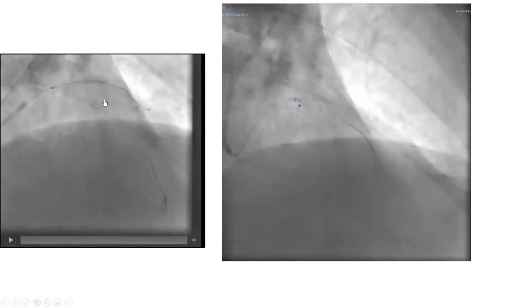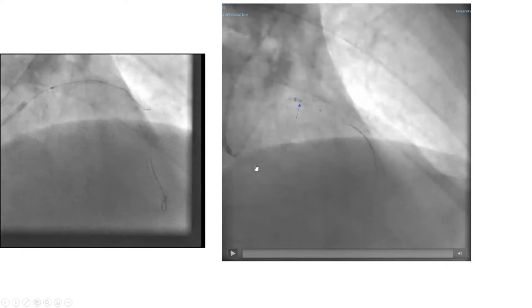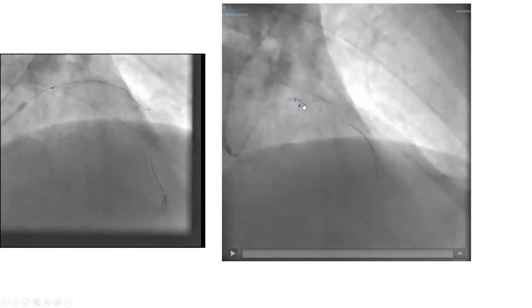We tried with the support of a guideliner a Mamba Flex catheter, and we tried a Sapphire Pro balloon — one millimeter, which is the lowest profile balloon. We still could not advance. The balloon is getting hung over that fibrosis area.